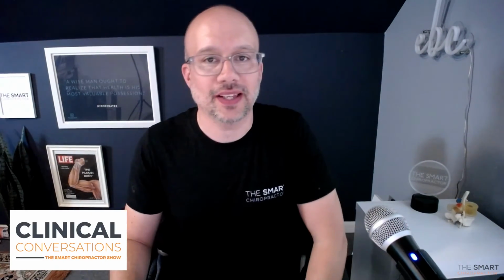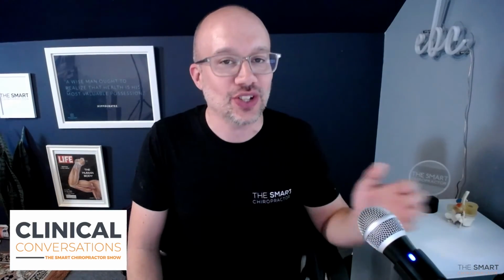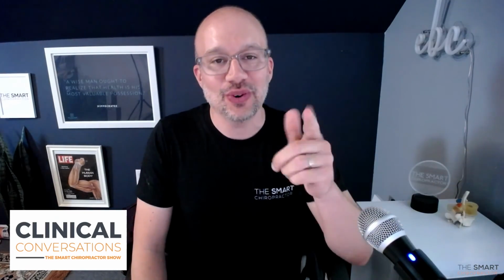All right, and that is a little bit of a presentation from Nick Lancaster on functional spinal imaging from Axis 2021. I'm excited about the future of spinal imaging because there is so much. Nick started to lay out some of that there. If you were at Axis 2021, you heard it all. But there's so much advancement in technology, whether we're shooting films weight bearing, that's beneficial. Of course, if we're able to shoot them through a full range of motion, that's even better because now we start to really dynamically understand what each individual is dealing with.